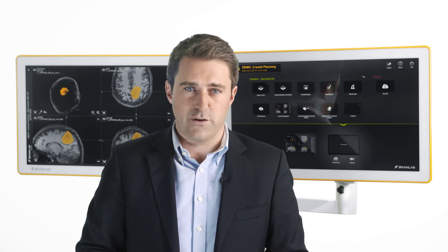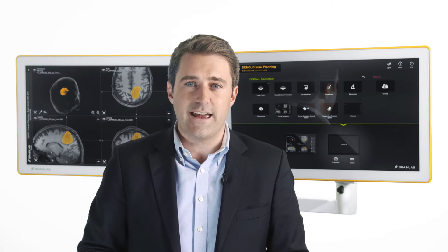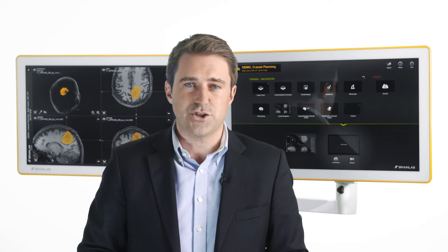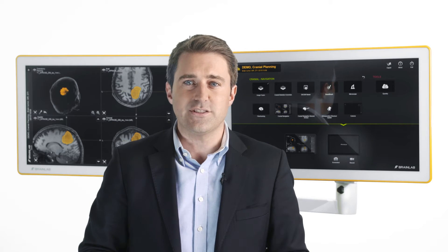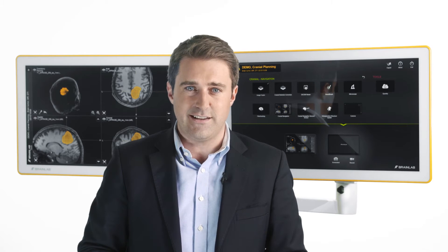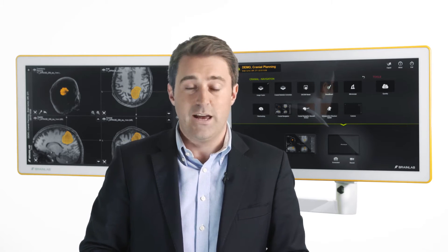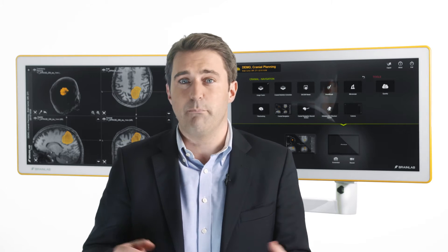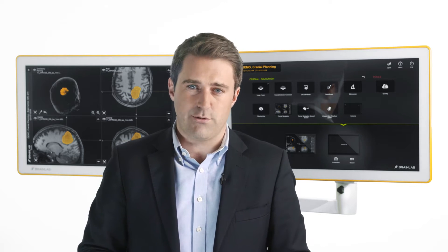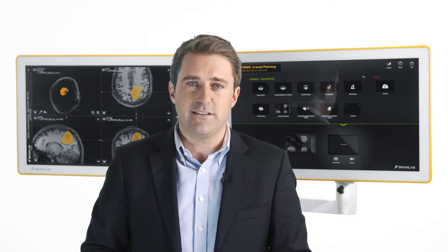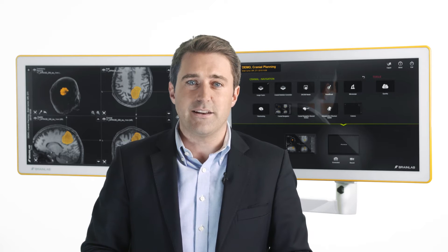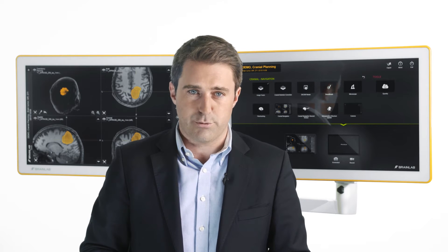With this software workflow, surgeons are able to easily process and visualize Diffusion Tensor Imaging data. Denoising, motion and eddy current correction are already done in the background, streamlining the import process.